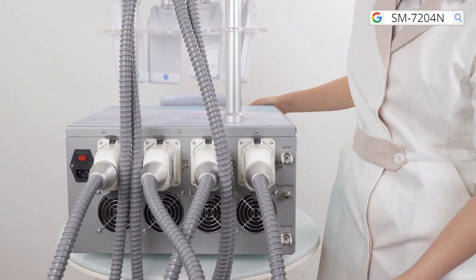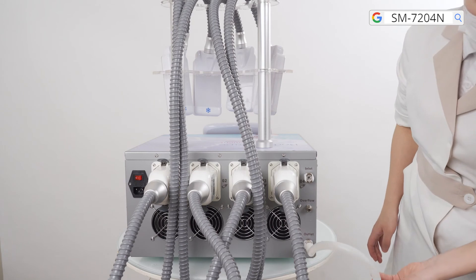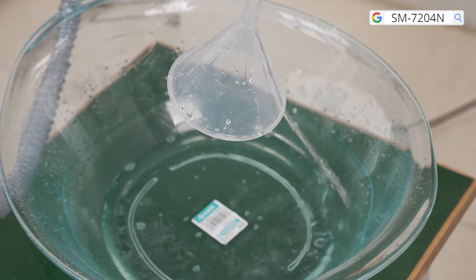To empty water out of the machine, connect the hose of the funnel to the water outlet and make sure it is fixed by the fastener. Let the hose hang down and water will automatically run out.